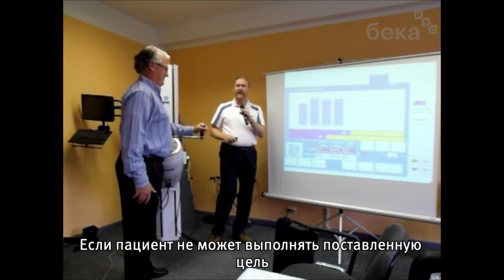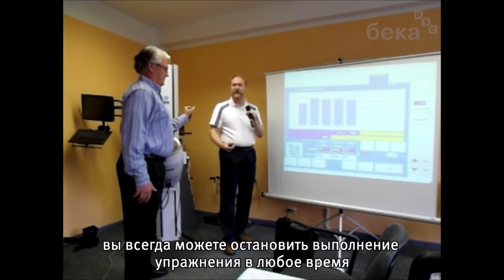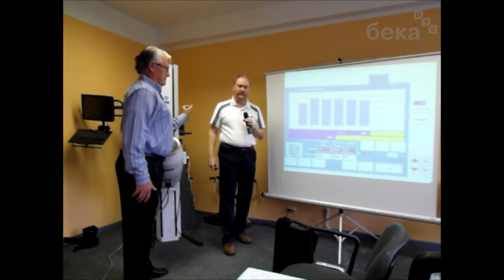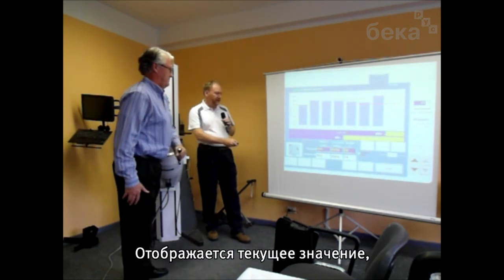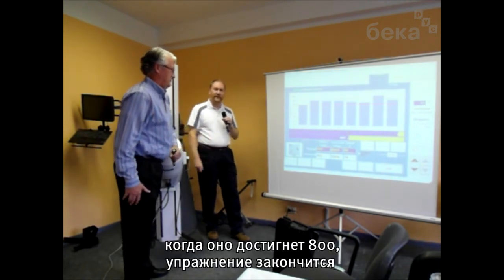If the person cannot finish the goal, if they get fatigued before the car gets to the end, you can just press stop at any time to end that session. We're showing his current values. When it reaches 800, it will stop the exercise.